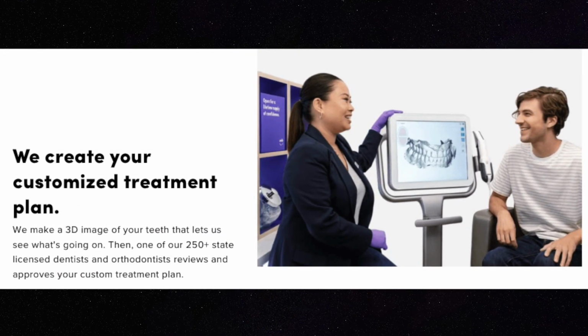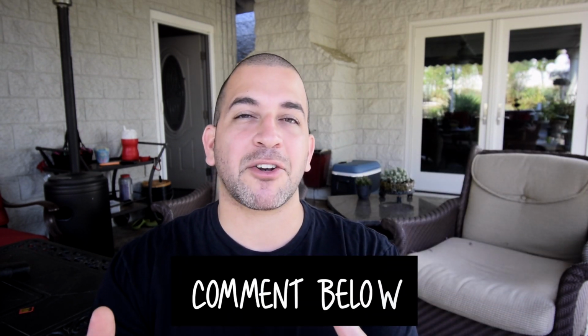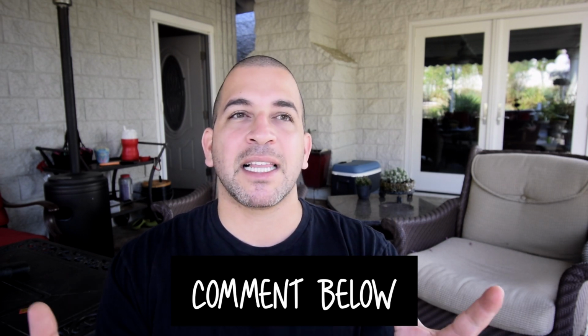Now, according to the website, they do say that when you send the impression back to their company, they have a dentist or orthodontist that reviews the impression to make sure that it's accurate. But just knowing how difficult impressions are to take, especially on my own patients, I have a little bit of reluctance to believe that people can take their own impression and get it really accurate. And the reason I'm concerned is because, like I said, it needs to be accurate so that when you're done with your aligner therapy, it looks the way that we planned it to look. So that's just a concern of mine. If there's anyone out there that does use Smile Direct Club and they've done this process, please let me know some more information so that we can understand the process a little bit better.